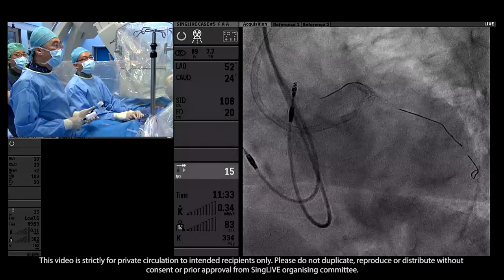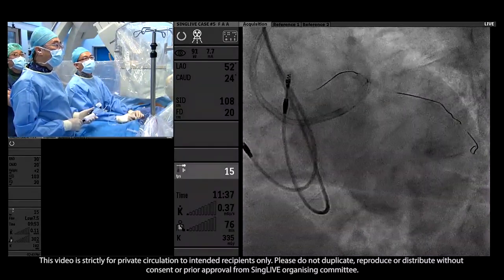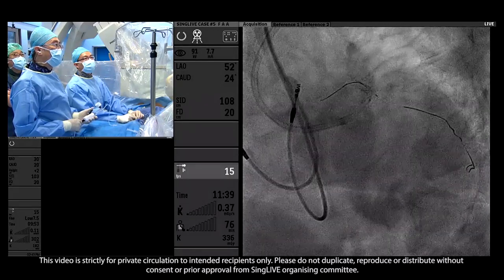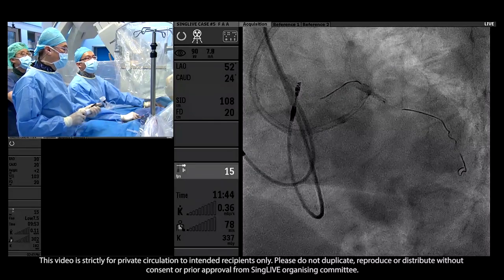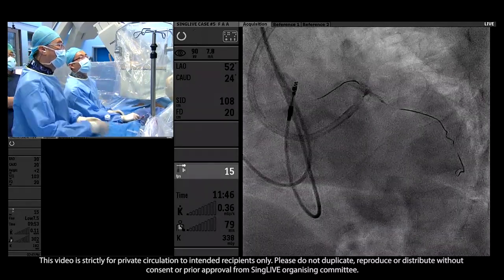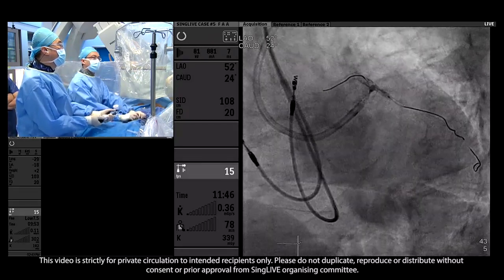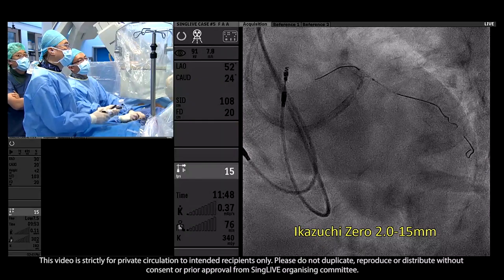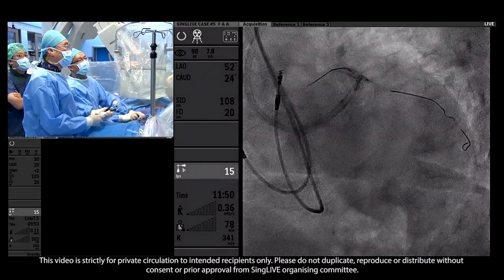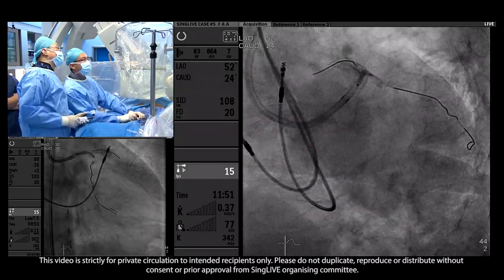So any comment from the panel? I think it's going to be hard to get a stent round. Yeah, so I think just a bit more post-dilatation. Okay, great, wonderful. And this was a used 2.0 balloon. Then finish off with a drug-eluting balloon, and we'll be done. Okay, done. The LAD wire is coming back. An option is actually to put in a guide extension catheter.